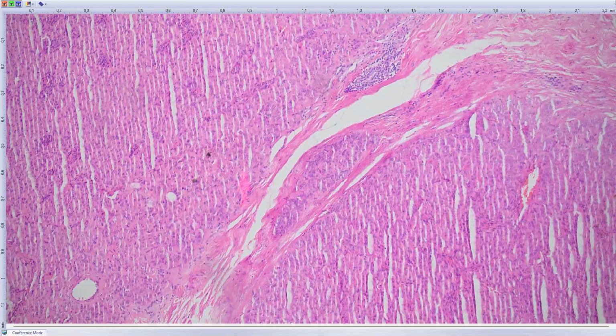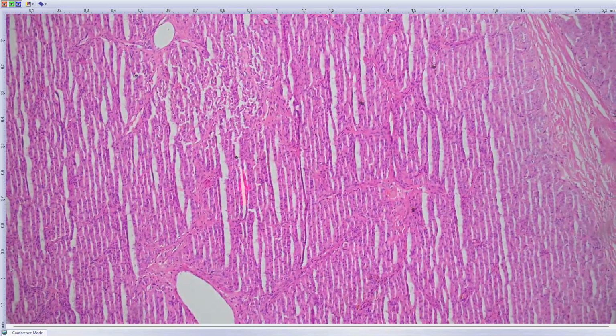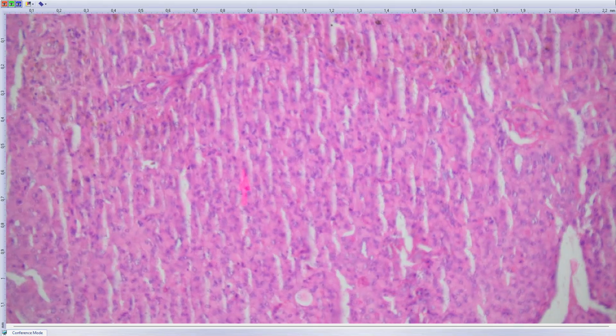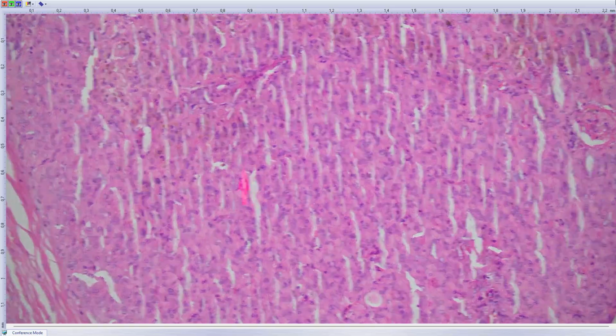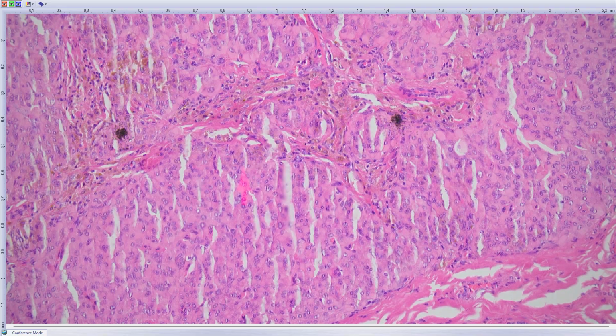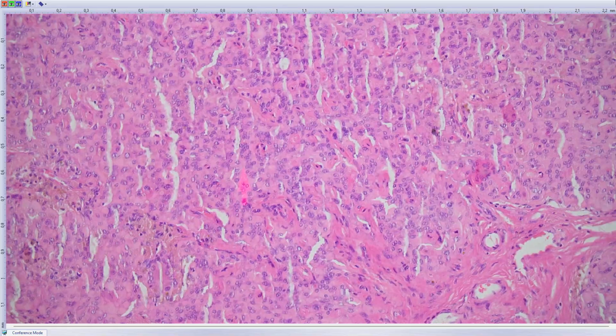This is a salivary gland from our files. I just played with it, and you see the typical morphology of it, of so-called hyaline cells. It was fully 100% positive.